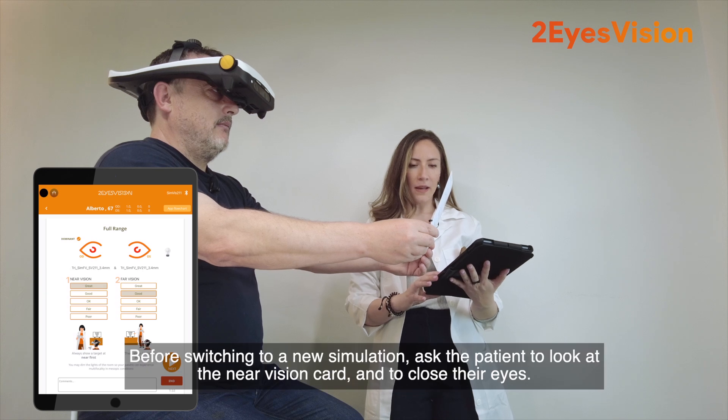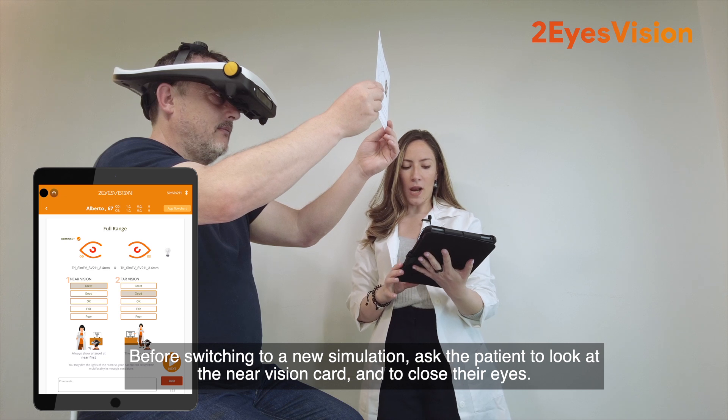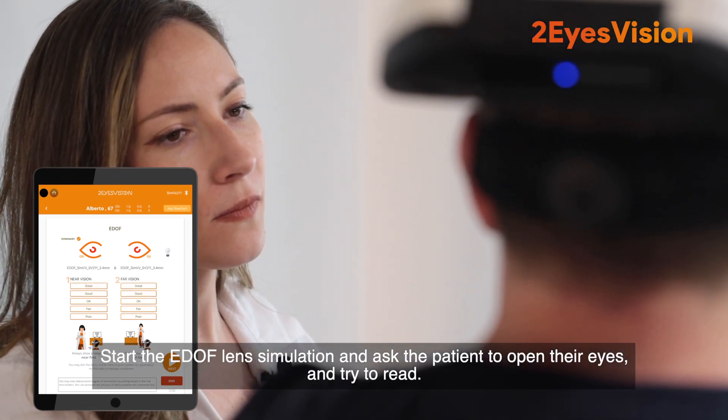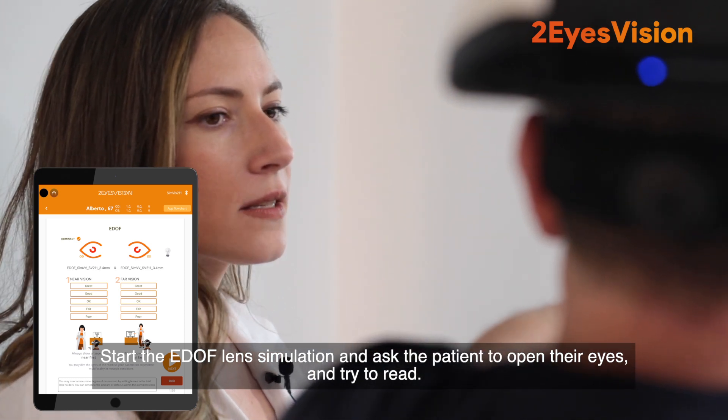Before switching to a new simulation, ask the patient to look at the near vision card and to close their eyes. Start the EDOF lens simulation and ask the patient to open their eyes and try to read.